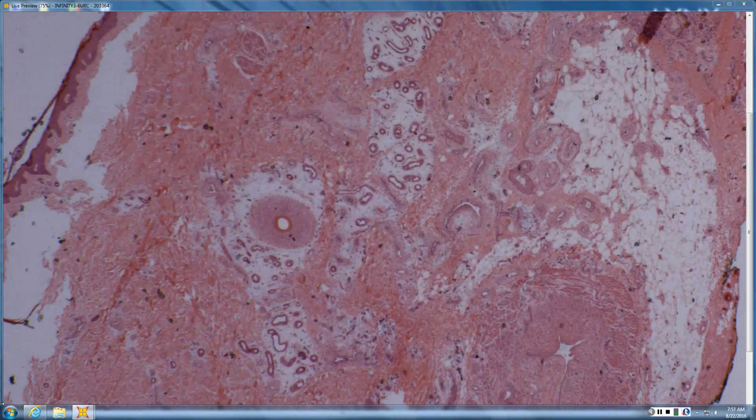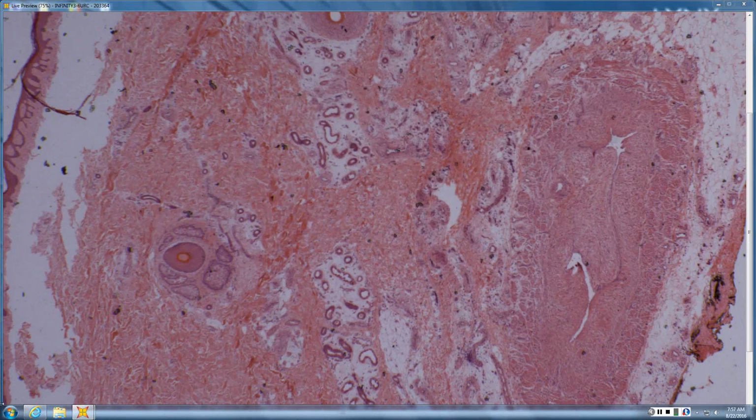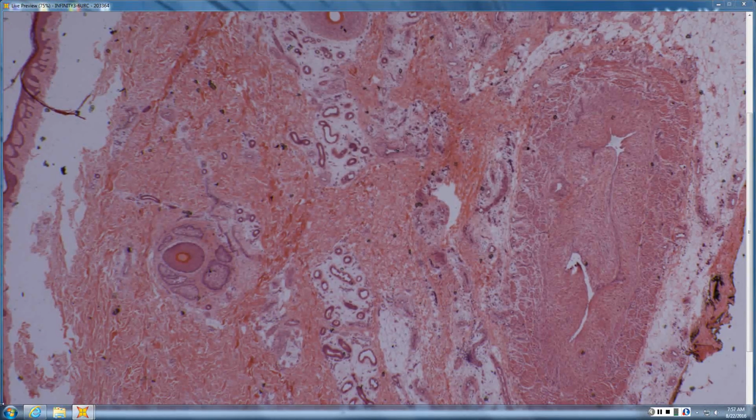They used to divide them into digital adenomas and digital adenocarcinomas. And then Wayne Duke did a follow-up of all of the adenomas and what happened to the patients, and a significant number of them metastasized. So they eliminated the category of adenoma, and they're all considered adenocarcinoma. So here, you got a big vessel at the bottom, and then you have lots of sweat glands. In fact, lots of sweat glands. Is it normal to have sweat glands up around your hair follicles here in the hypodermis?